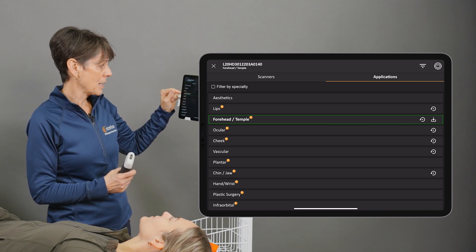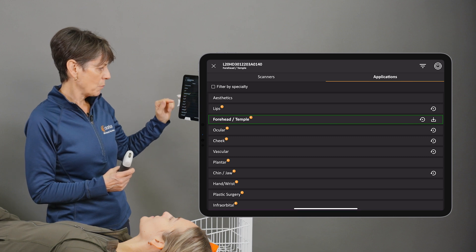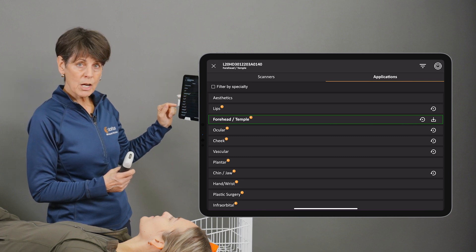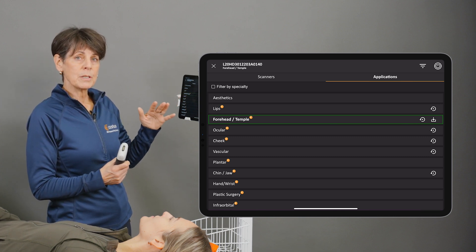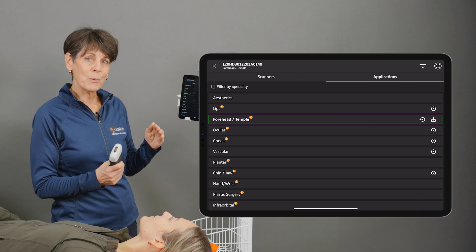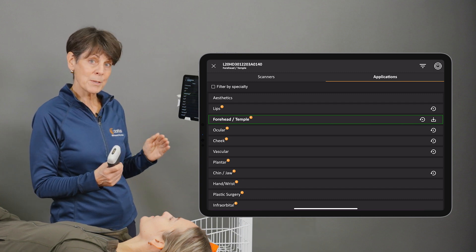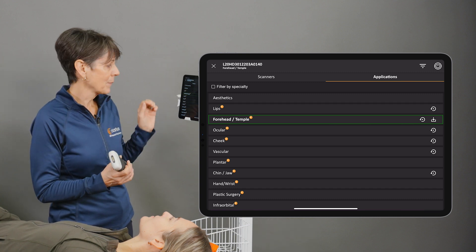So forehead, temple, lips, cheek, we've got chin, jaw — and that requires you, if you are moving around the face, to go in and change the presets to optimize your image for the area.